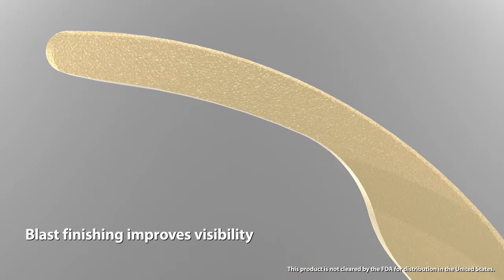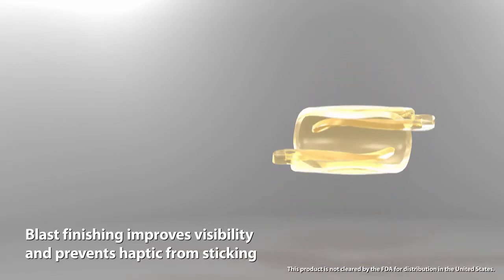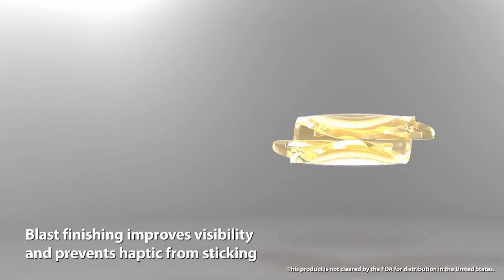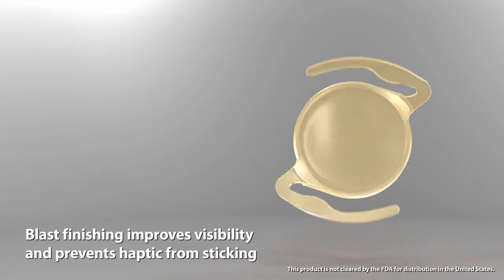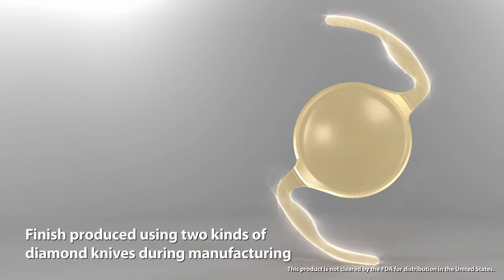Blast finishing on the haptic surface improves visibility and prevents the haptic from sticking to the optical surface while the lens is folded. In addition, it enables faster unfolding when injecting the lens into the capsule. This finish is produced using two different kinds of diamond knives during manufacturing.